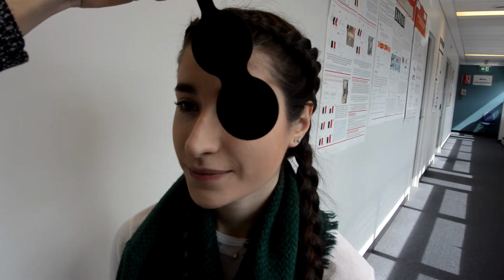HOVTV. Okay, cool. So can I get you having a look at that O for me? Alright, so keeping your eyes on there. Good, still looking at that O.